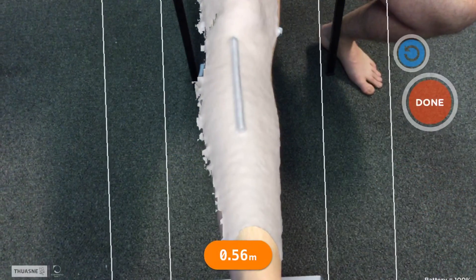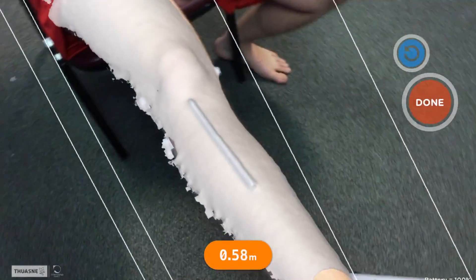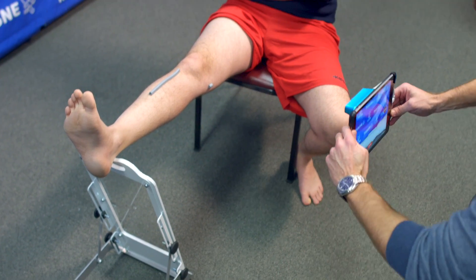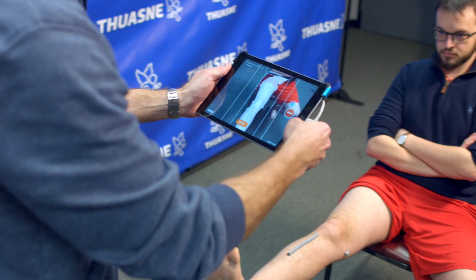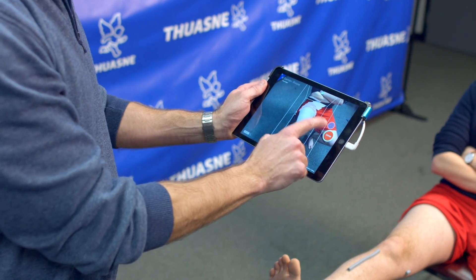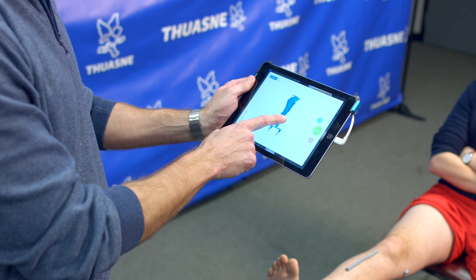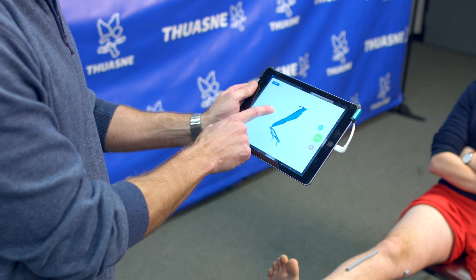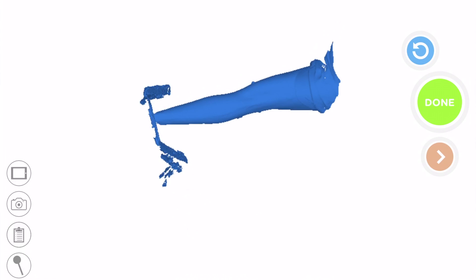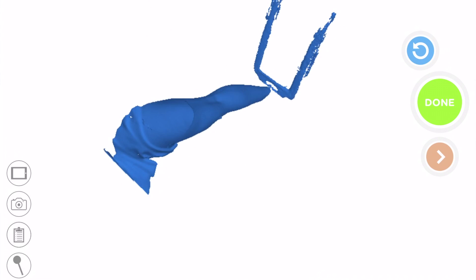When you begin your scan, you will see that your scanning subject is appearing on the scanning screen in a white pixelation. Proceed to capture the subject in a full 360-degree global view. After you are confident this has been accomplished, press the red Done button. At this point, the app will automatically generate a full rendering of what you have scanned, and you can review it in full by swiping your finger across the screen. Make sure you have captured the full anatomy and your scan does not have any holes or gaps.